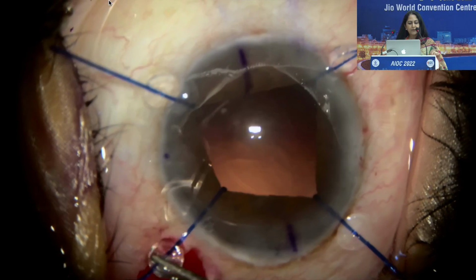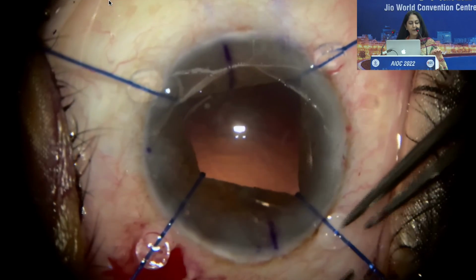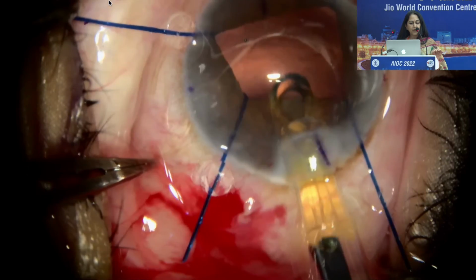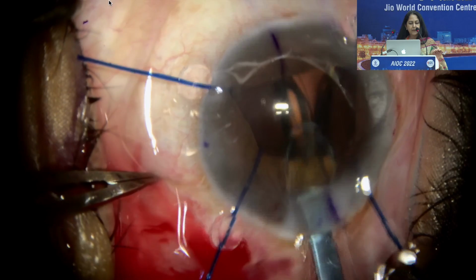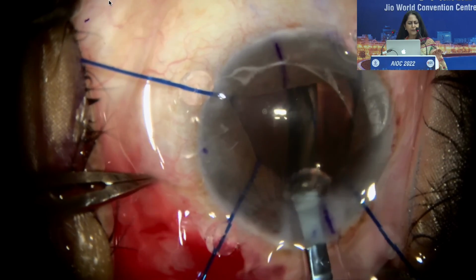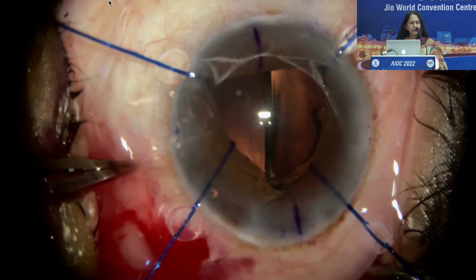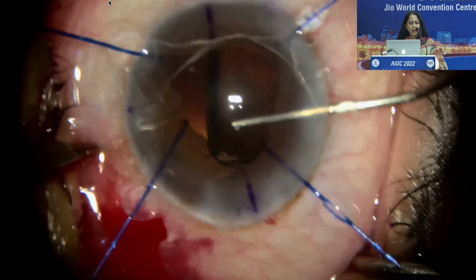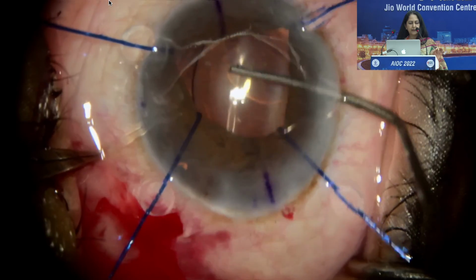Because you can release it, like I released it now. But because I don't want any incarceration of the iris tissue into the injector while I'm putting in the lens. At this moment, it's quite a reasonable size dilatation of the pupil. The lens has been put inside the eye. We can see it well, and it is dialed in at the right place, right axis.